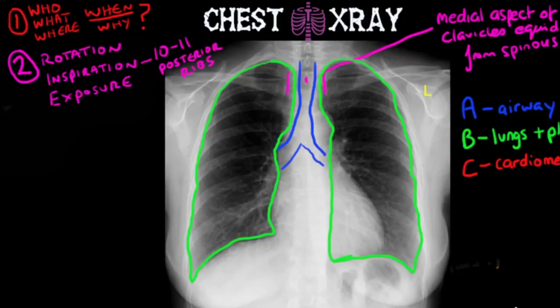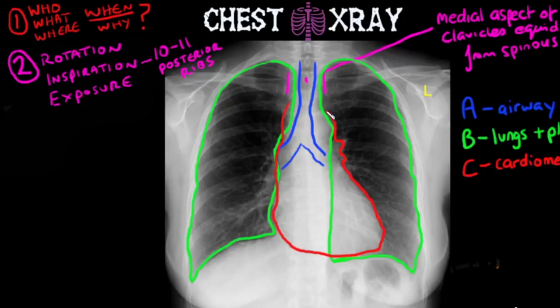For C, you are going to be looking at circulation or the cardiomediastinum. You are going to try to trace the outline of the heart, starting on the right side, tracing round the apex and then the aortic knuckle. You are looking for an enlarged heart or a wide mediastinum, and we will talk about reference points for sizes of particular anatomical structures in a moment.